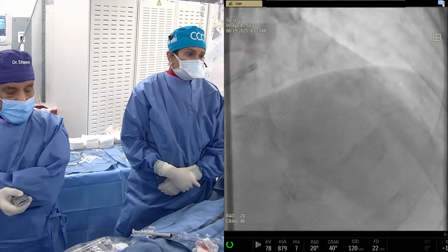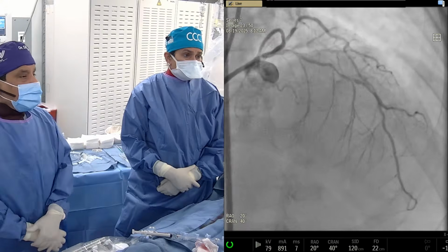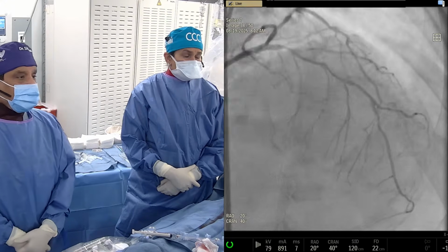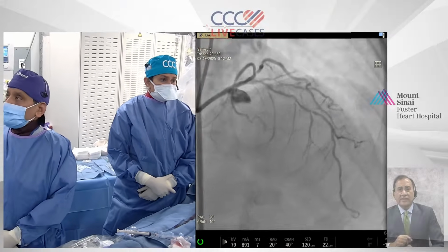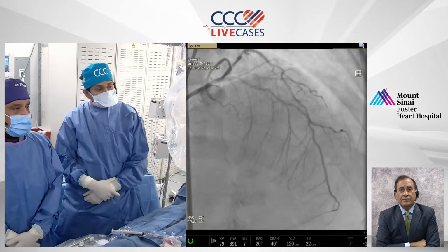The only question is, what are the chances, based on our criteria, that we will come out without stenting the diagonal? So you're talking about the lower of the two diagonals, no? Because there are two diagonals. Yeah, one very small, the real D2. Right, D2. I know, what do you think, can we come out without stenting?